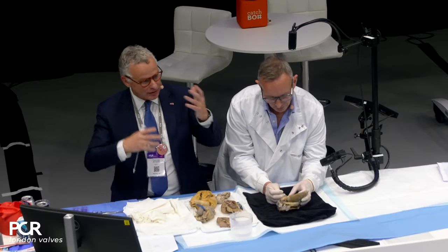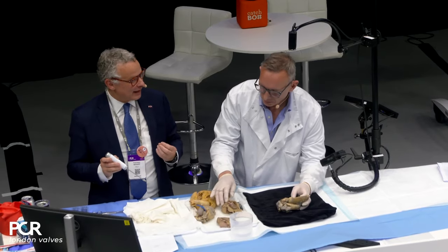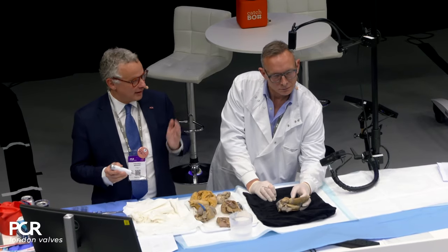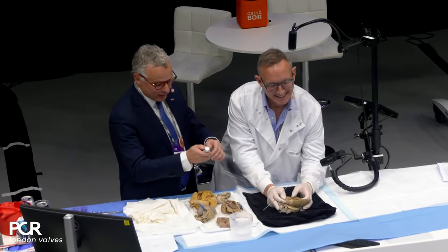There is asymmetric jet, whatever. We're discussing it, and then he comes and says, "You know, you have to put it in the middle." And I thought it was a stupid idea. Why middle? It's on the other side. You have to put it in A2, P2, go. He was right. You should put it in the middle first. And then Antonio is always right.